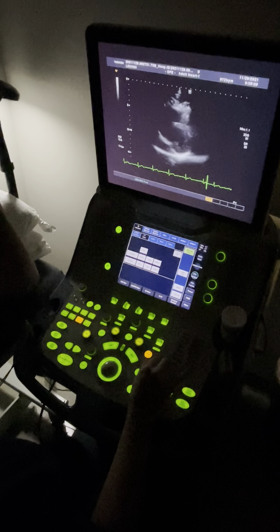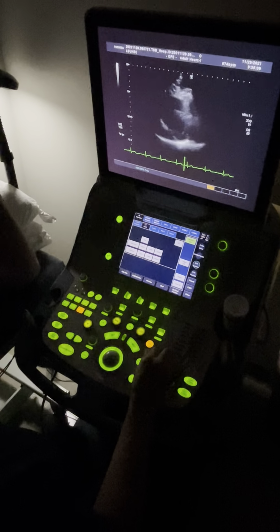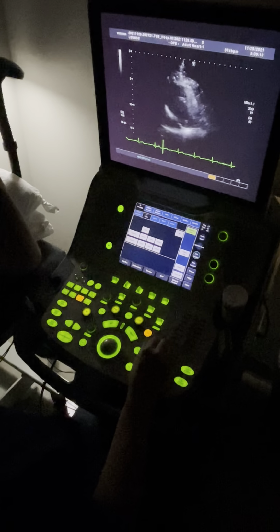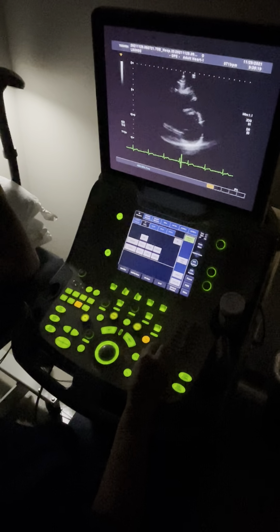For the apex, are you going to slide down or are you the same? I actually pulled up on Paul. Okay. So for Kyle, you didn't. For Kyle, I probably pulled up a little bit, yeah. But not, like, I did that's fine, Paul. I guess it just depends.